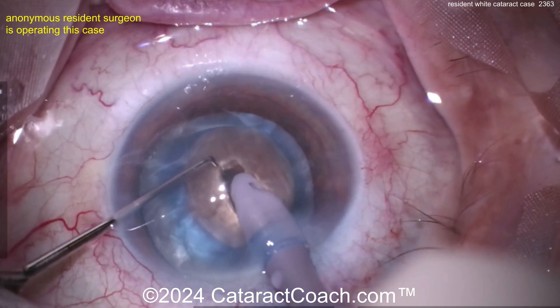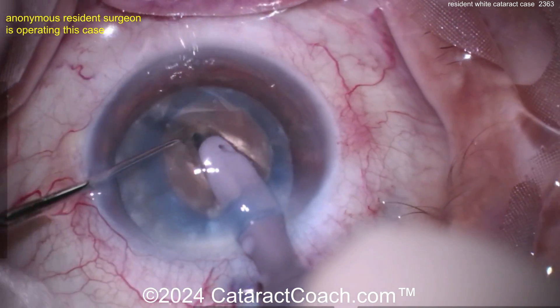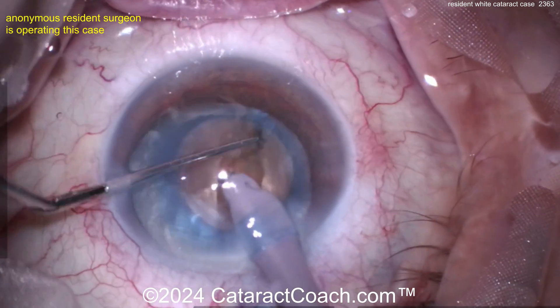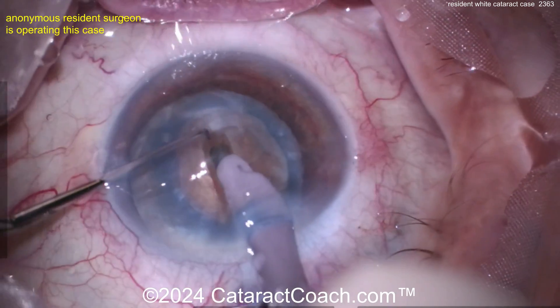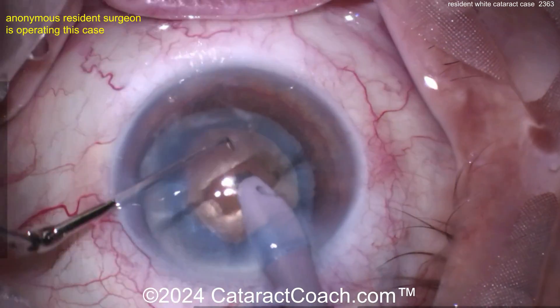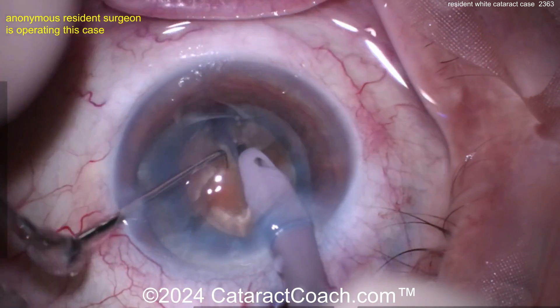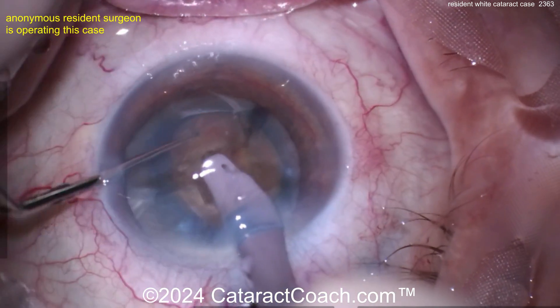I like your attending helping out with a squirt bottle. Now a little bit of a mini trench and then a vertical chop — pretty good actually. You have very good hands. And then chop again — very nicely done. If only you did better draping. I'll give your draping a low grade, sorry.